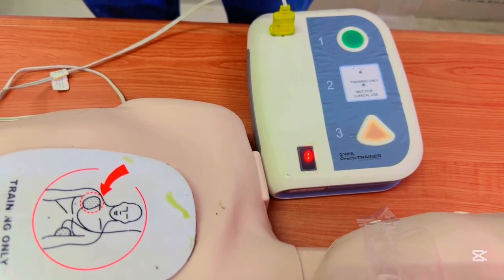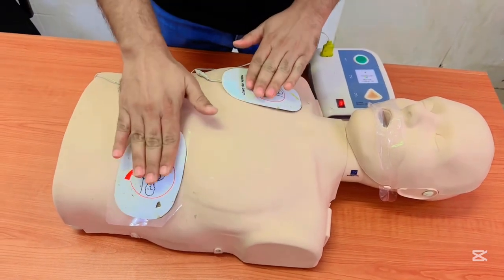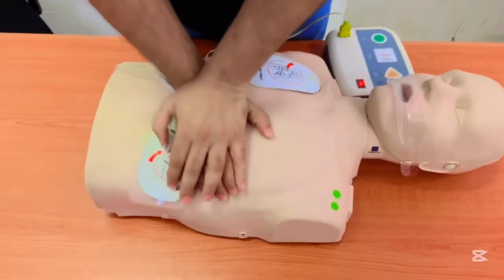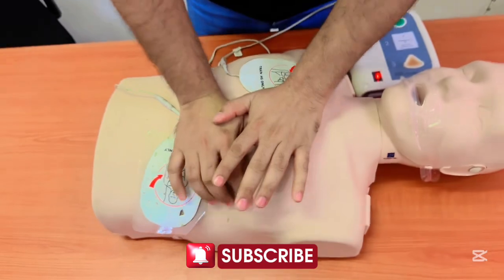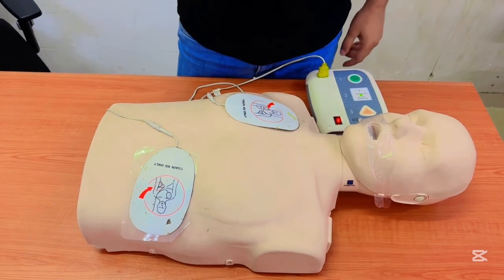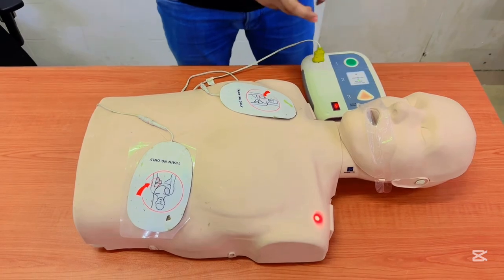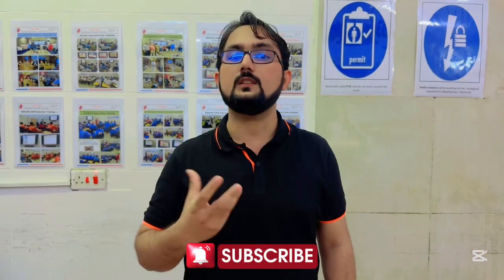Begin CPR. If there is no response, we have to continue manual CPR without removing the pads. You have to continue the CPR until we get some response. The AED can also be used for an additional shock, but by that time you have to give the 30 compressions, then you have to give a breath, then again continue the CPR. So this is the right procedure for how we can use the automatic defibrillator for the CPR procedure.